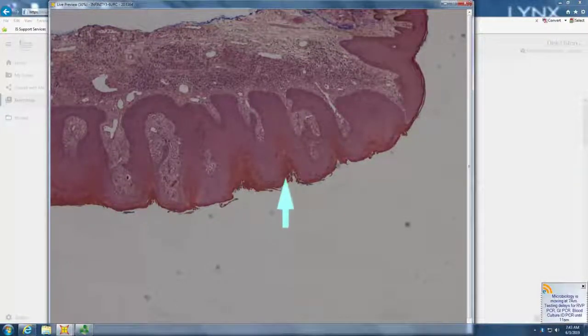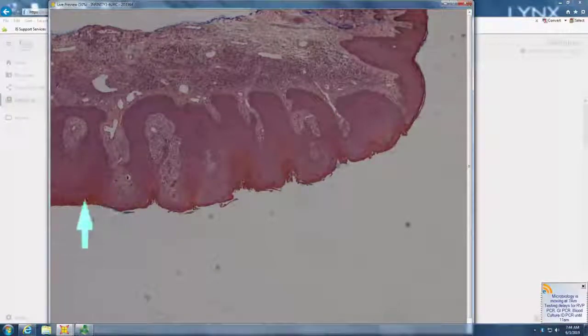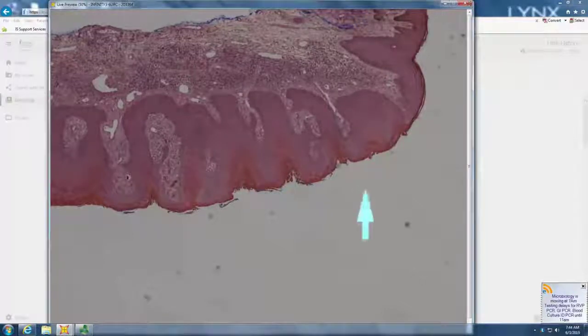You can also consider them arrows pointing, saying, hey, look down here in the papillary dermis. Because unless you look at high power, you're going to miss those few xanthoma cells down in the papillary dermis. All those red V's are trying to help you out. How many times do I have to point down at the papillary dermis? 1, 2, 3, 4, 5 red V's, all pointing down and shouting the name: I begin with a V, verruciform xanthoma.